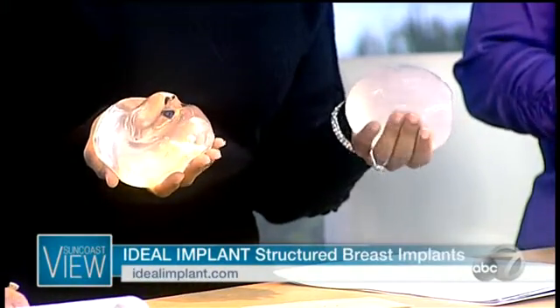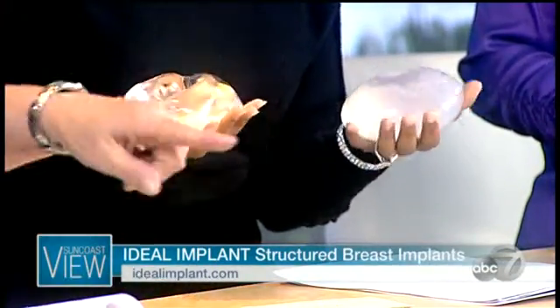So if this is something you're considering, what would make you a good candidate? If you really had the concern and you didn't want to have to get an MRI every 2 years. Of course you want to make sure that they're safe, but the FDA says you should go every 2 years when you have a silicone implant just to make sure you don't have those silent leaks. This is just saline. Is this one that leaked? Yes, this is what it is inside of there, and you can see that's what they're talking about. Oh. Yeah, it's got stuff coming out. So nobody really wants that in their body, right?